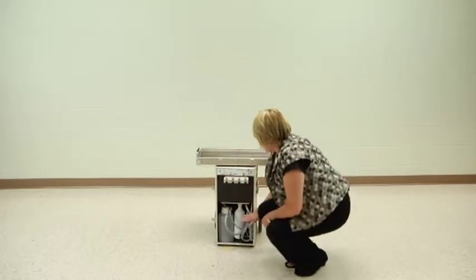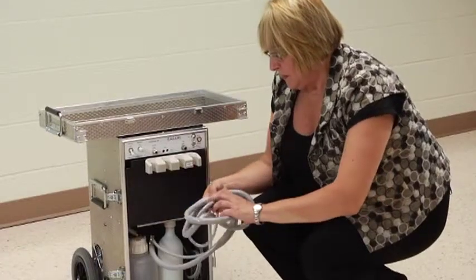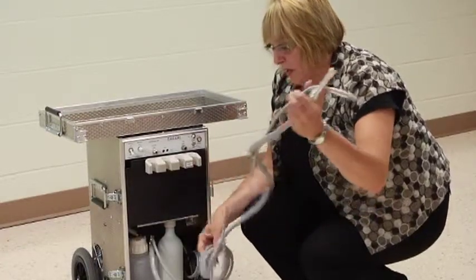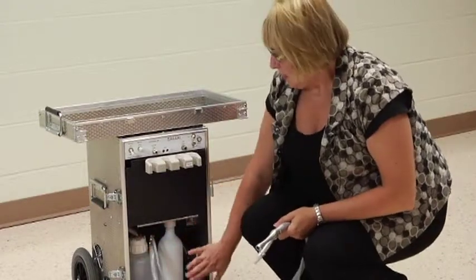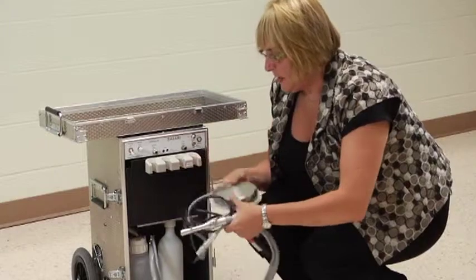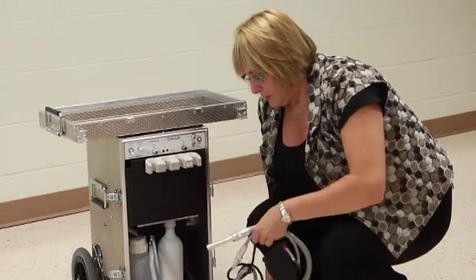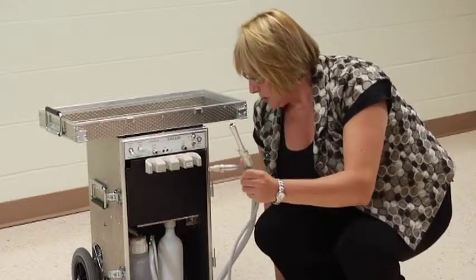If you come down to the bottom of the unit in the front, you'll notice that housed in the bottom portion are your high volume and low volume suction attachments, as well as your evacuation reservoir and your water bottle. There are also two rheostat foot pedals housed in the bottom — one for your hand pieces and one for the suctions.